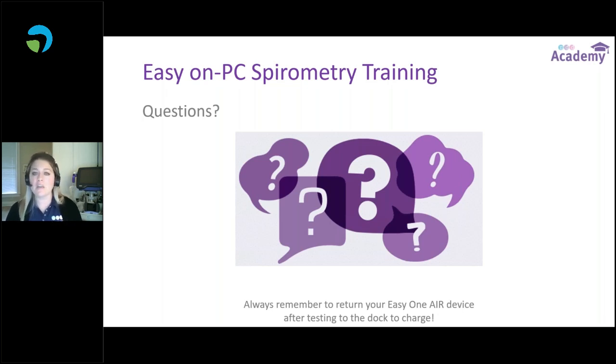If you're working in research or occupational health, you absolutely can check calibration with a 3-liter syringe on this device. But essentially, when we block the mouthpiece, it's not really a calibration. It's just taking in all the environmental factors and preparing the sensor for the test. So it is a checkpoint, but not technically a calibration. Hopefully that was clear as mud.